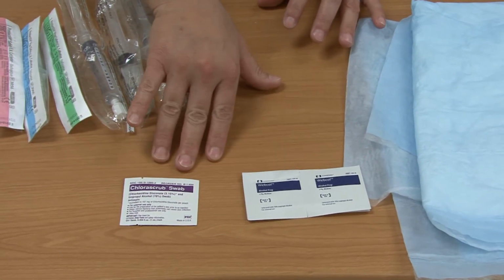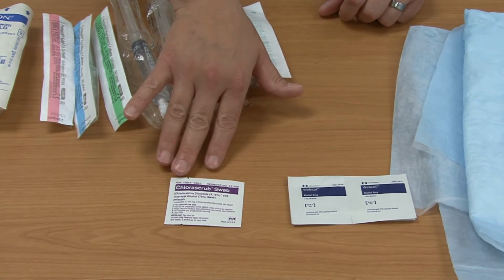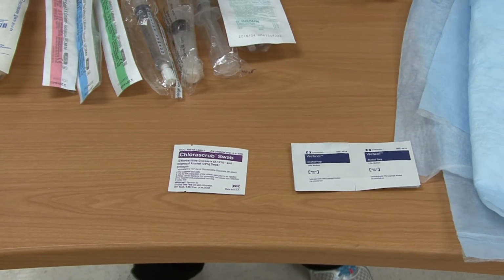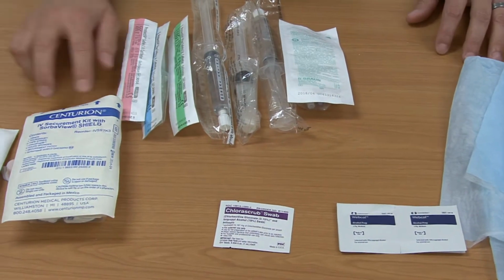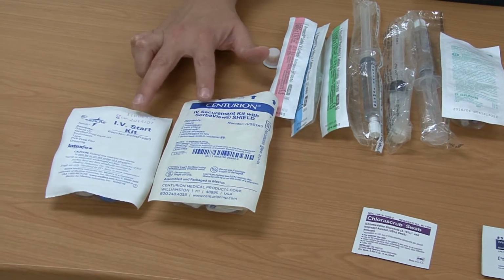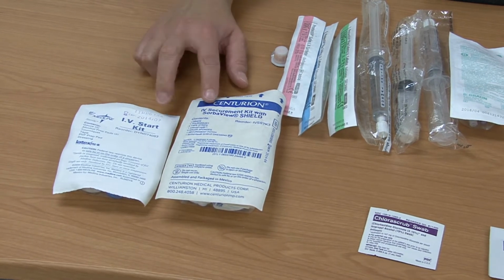But then you'd also need whatever your appropriate cleaning agent is for your agency. Most agencies are now using the chloroprep or chloroscrub. Some agencies still use alcohol. Some agencies use betadine. So make sure you check your hospital policy so that you know what you're using. Most of your cleaning agents are going to come in one of your IV start kits. Most of your agencies have these, and in the start kit, typically you'll have the cleaning agent.